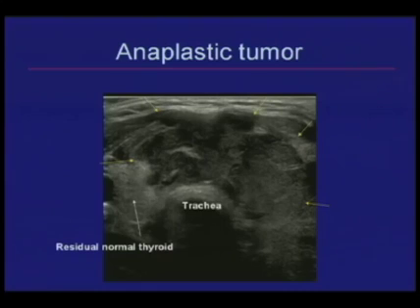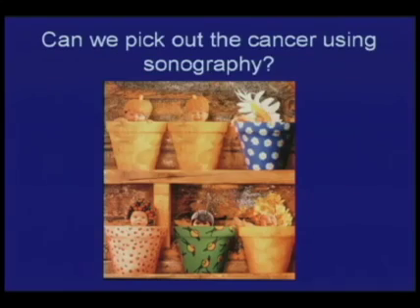This is typically a very large, infiltrating mass with a rapid growth pattern. These patients come to clinical attention by rapid enlargement of their neck and/or airway compromise symptoms. Here we can see a very large hypoechoic thyroid mass outlined by the yellow arrows and the normal thyroid in the right lobe left behind. These are more common in elderly patients.